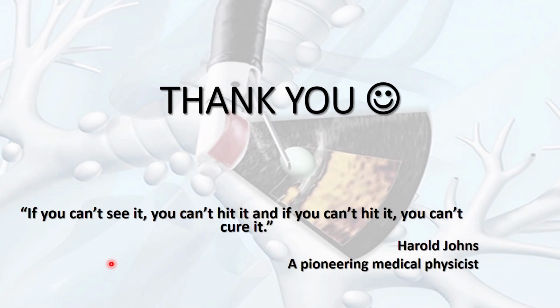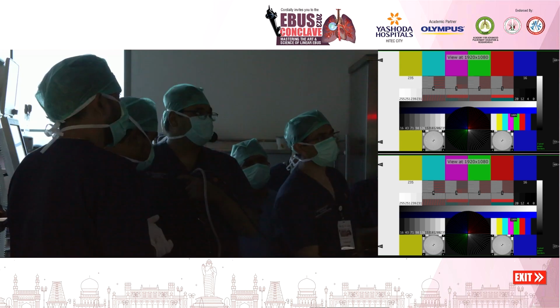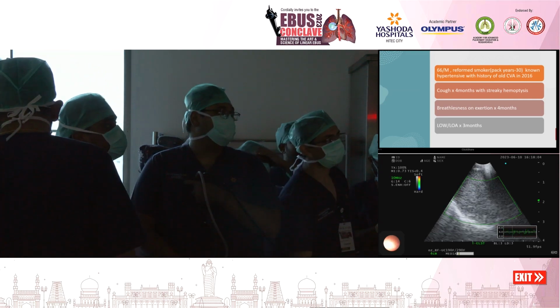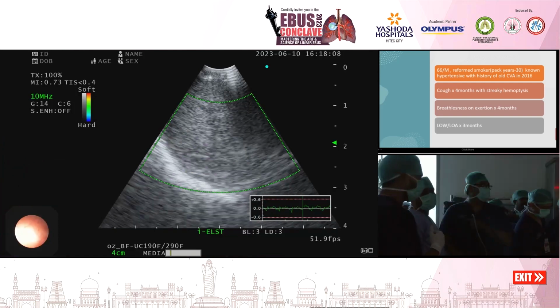So definitely PET scan has a significant role in malignancies, both pre and post, I would say. Pre, it will help us target the node, and post, definitely if you have a malignancy resectable, we would still do it. So for want of time, I think we will quickly start the third case.